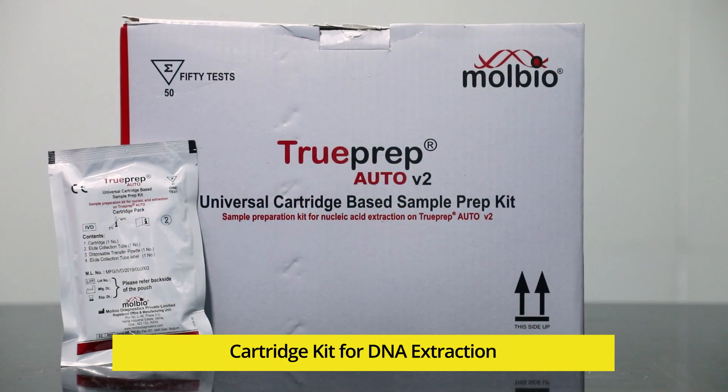After processing the sputum sample, let us see how to load it into the TrueNat cartridge for DNA extraction.